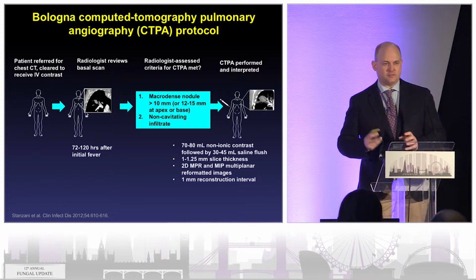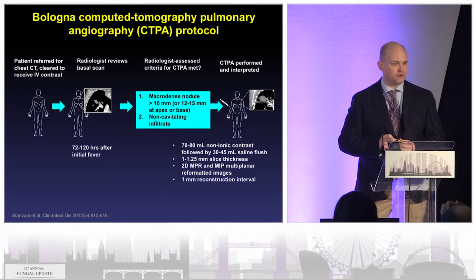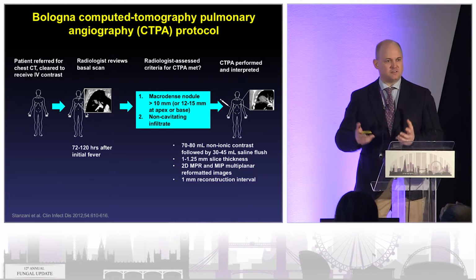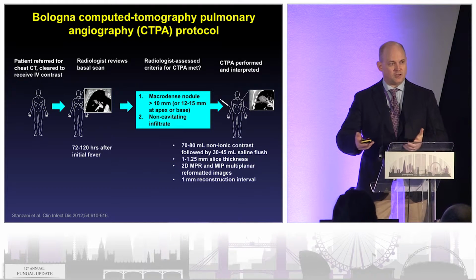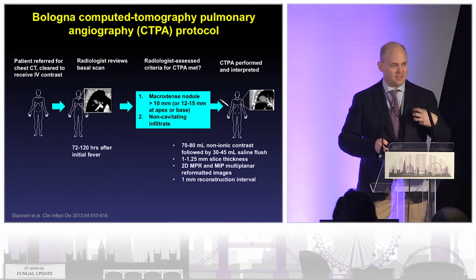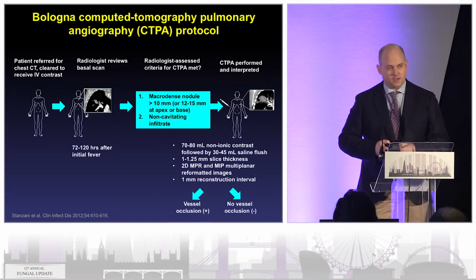Probably the only thing that's different or unique from other pulmonary angiography is the reconstruction techniques. It does take a little bit of training, but I think the potential is exciting if you think about this as a test that all hospitals have. If you can train radiologists to do this, then potentially you can have an answer within 15 minutes about whether this process is angioinvasive and whether there's thrombosis inside the infiltrates. So within about 15 to 20 minutes, we can say whether this vessel shows occlusions or not.